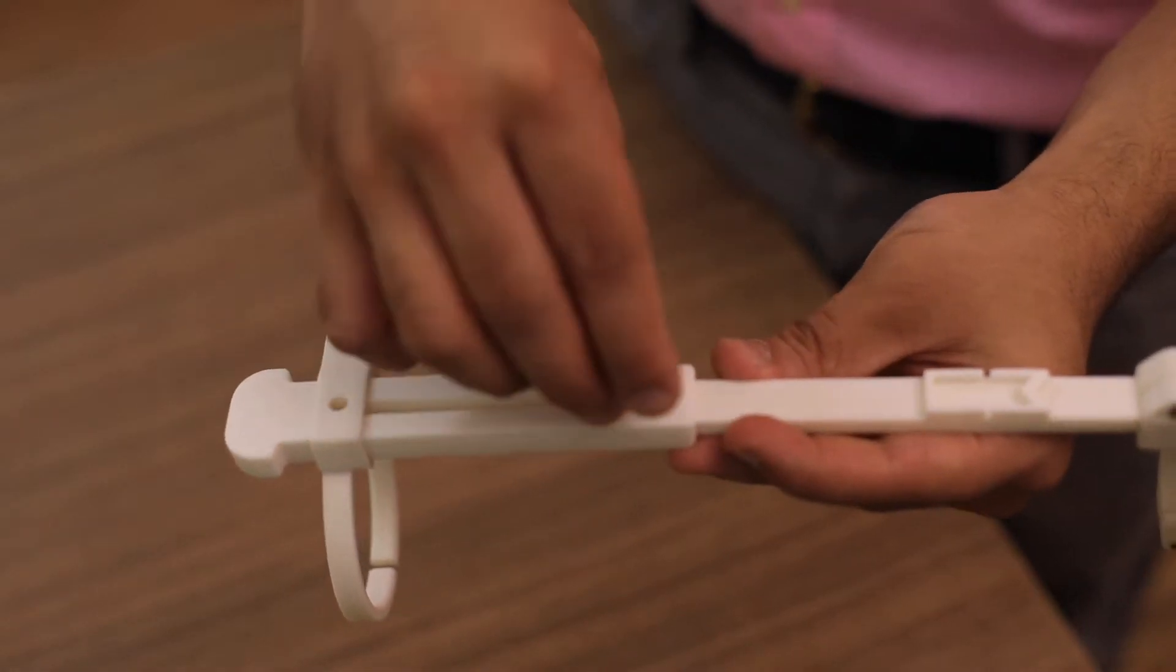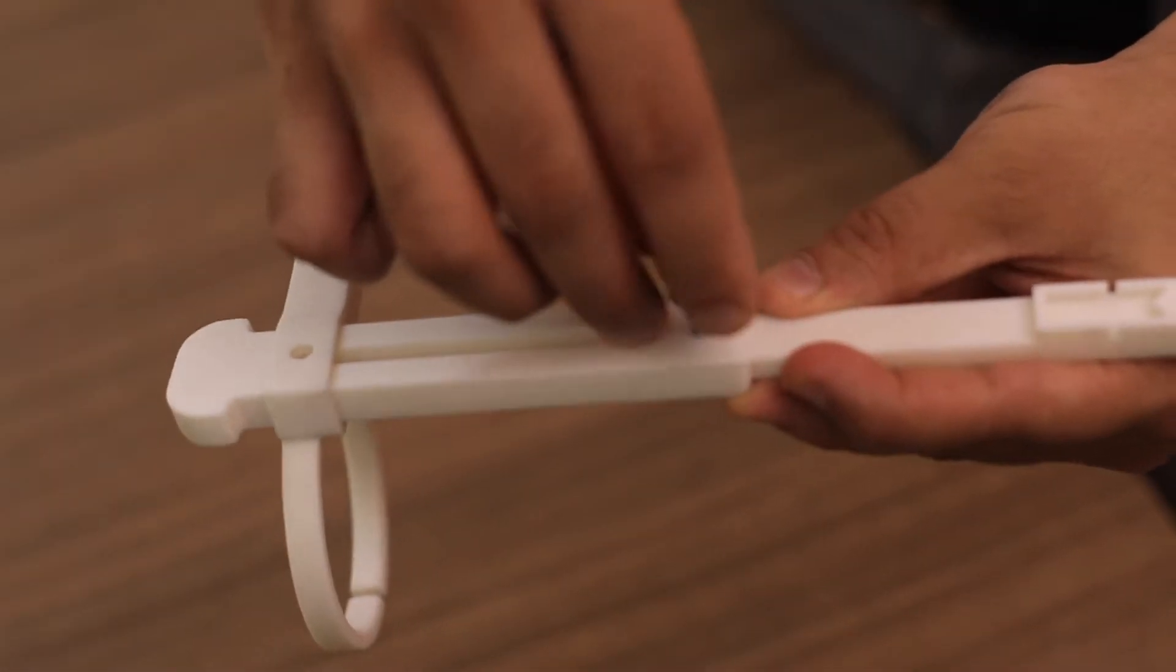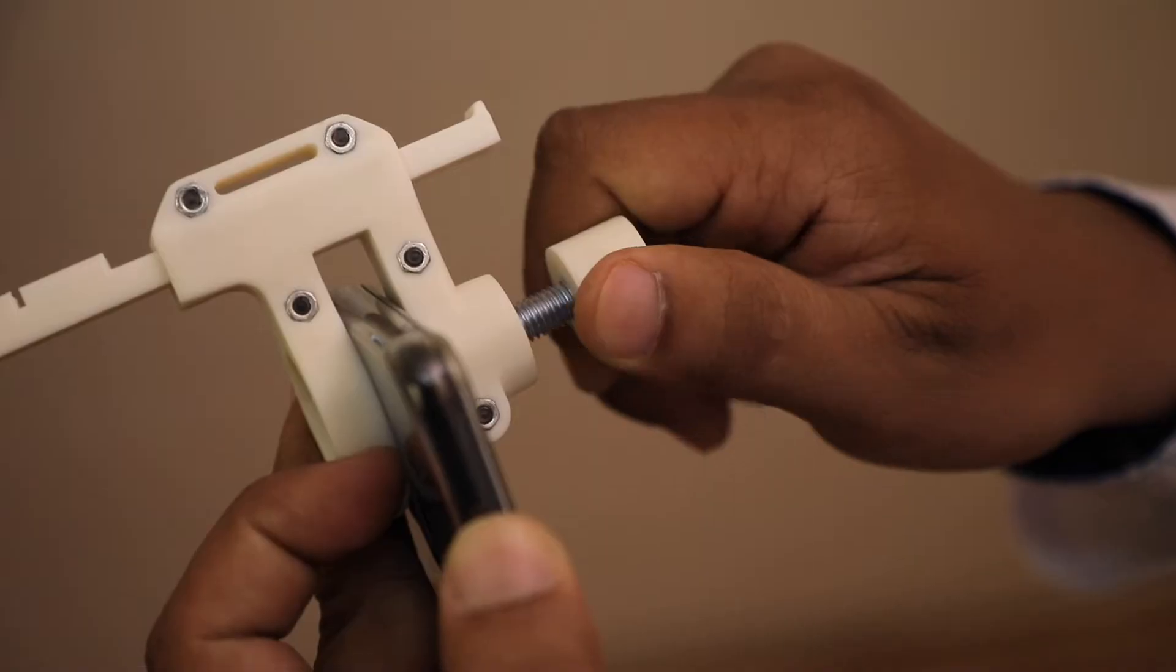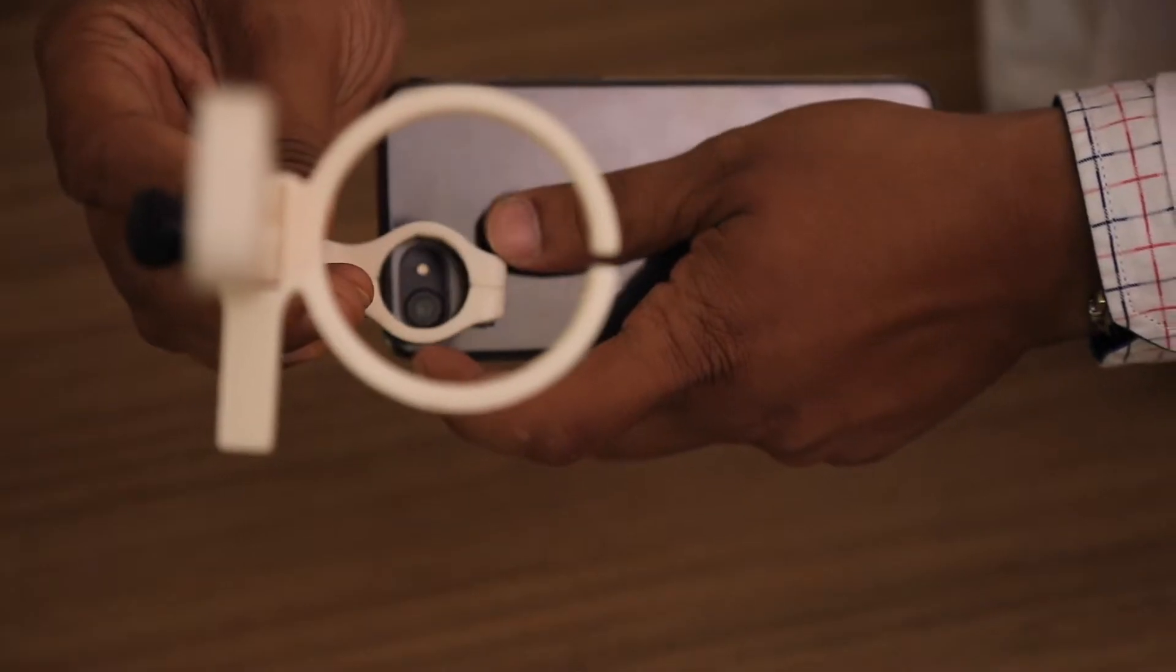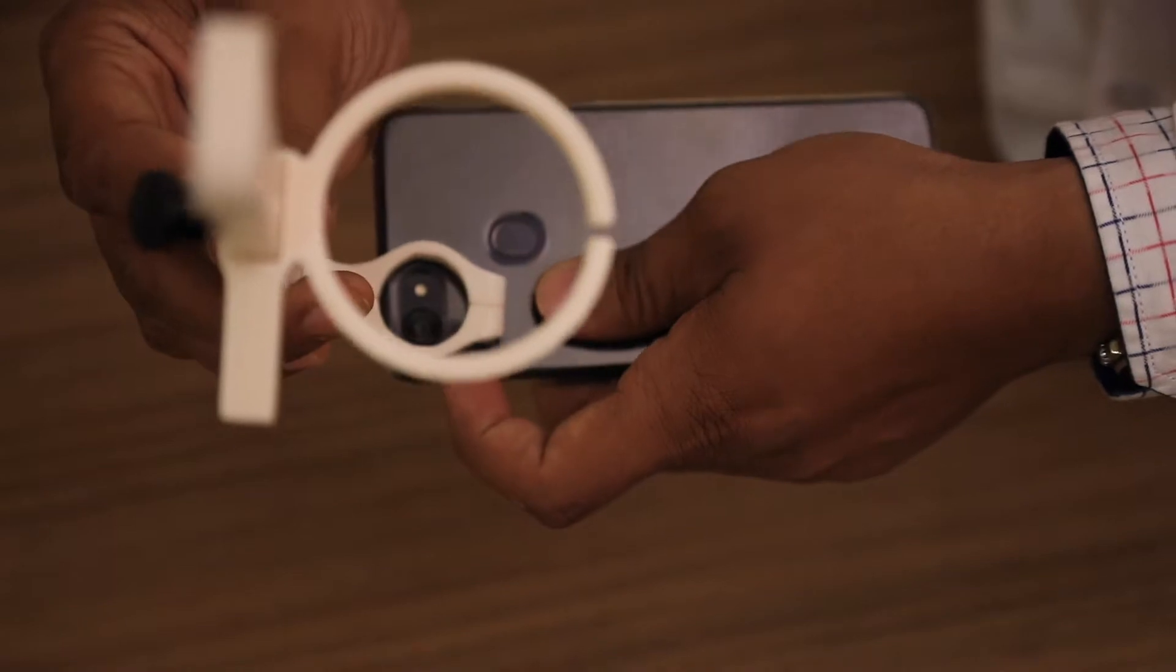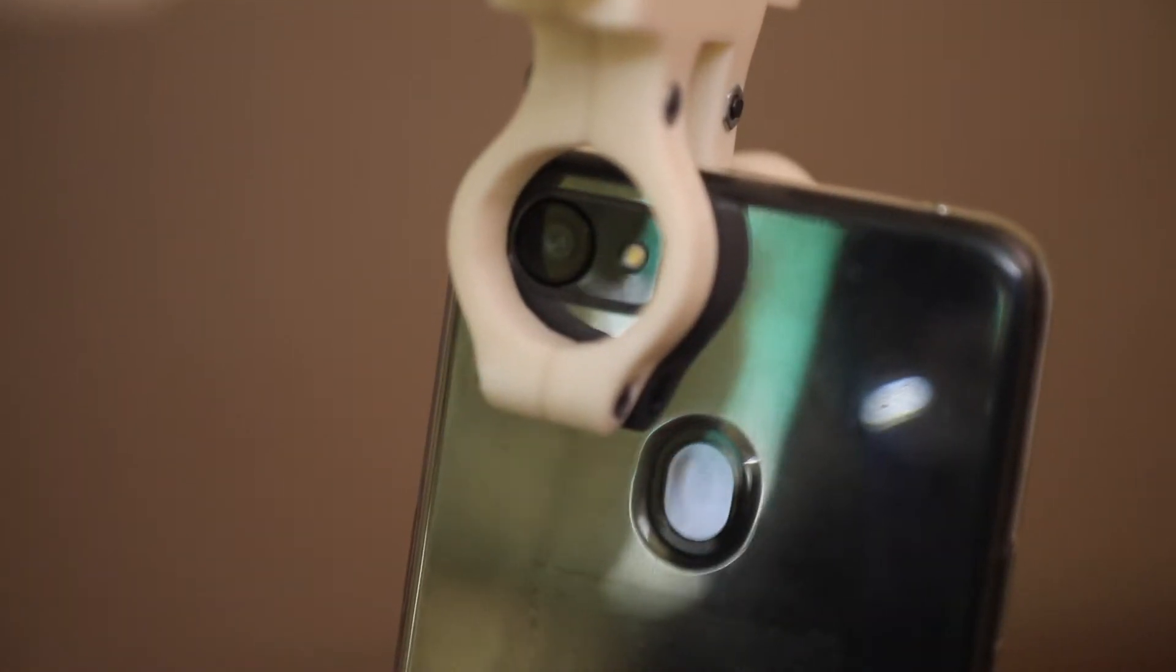Screw in the knob and it's ready to use. Connect your smartphone by tightening the screw at the end of the device. Make sure the camera and flash are within the circular area. It works with the majority of Android and iOS phones.